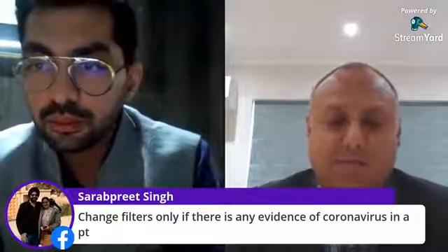So you see, Keshav, pre the lockdown, do you agree that we were all in a phase whereby we don't know whether we had affected patients or not? Now we're talking about all these safe practices when it comes to cryopreservation, etc. But I'm pretty sure that there's a mass number of people who are asymptomatic but are positive for corona. That's true. These patients could have already gone through your system, and hence I feel as a clean slate. We change all the filters at Christmas anyway. I think we need to treat this as a Christmas closure, rather than risk assessing who we had pre-closure and who do we have post-closure. I appreciate there's a cost impact in all of these things, but let's treat this as a Christmas closure so that at Christmas we don't have to do everything again.